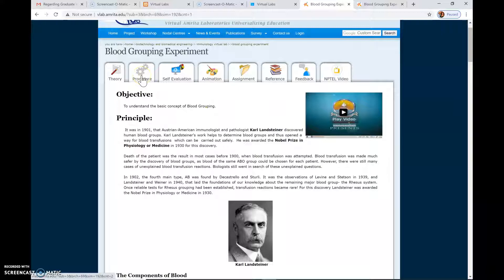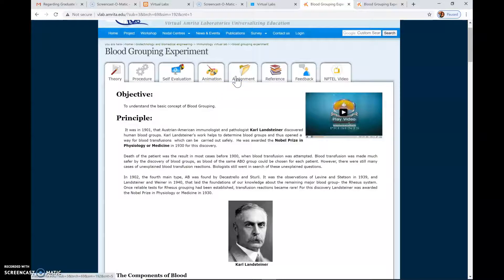Then you can go to the next tab of procedure — how to do the blood grouping experiment. There are also questions for self-evaluation; please go through them and attempt them. You may require downloading the Adobe Flash Player to see the animation. Please go ahead and study the assignments and the references.